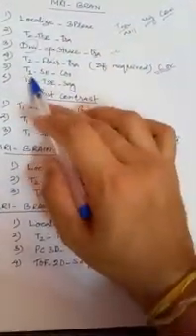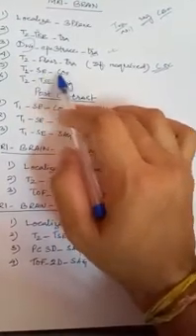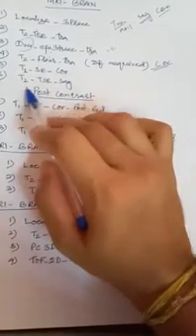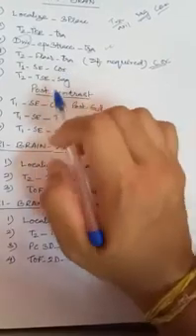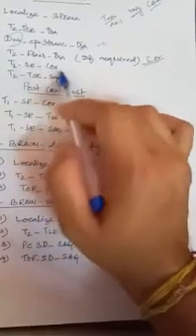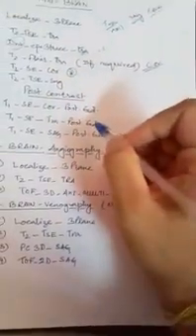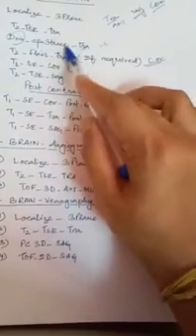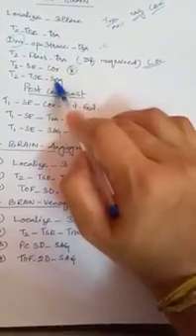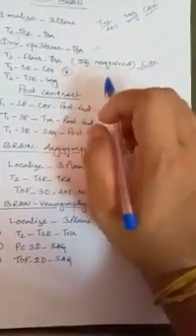Next we will take the T1 SE coronal. SE means, as I already said, spin echo coronal. Then again we are taking T2 TSE SAG, COR. SAG means sagittal, COR means coronal. SE means spin echo. So T1 coronal, this is also if required, then only we are taking. And basically for this we are taking axial, coronal DWI, T2 SAG. Okay, if sometimes some lesions we have seen, then we are taking the other sequences.